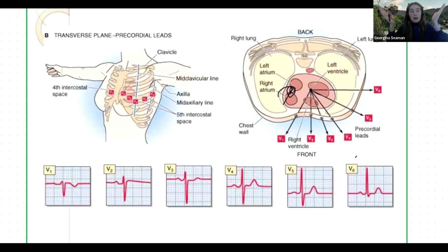So that's largely about the lead 1, 2, 3 and the augmented leads, is that it calculates the amount between them, and then that's how it measures across. So it calculates it for all those 3 views. So you couldn't do, for example, V1 to V6 without your limb leads on, because that's how it calibrates its voltage and amplitude. Is that probably a good summarization of it, Anita? You would probably know this better than I will.